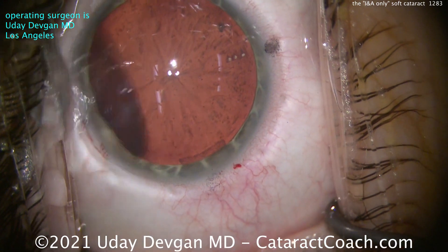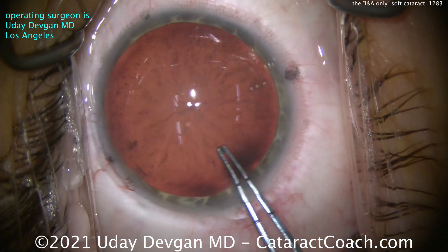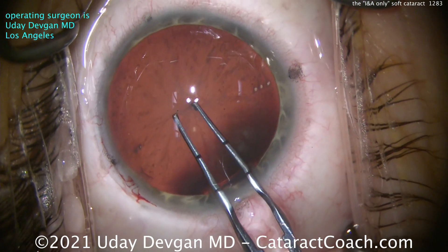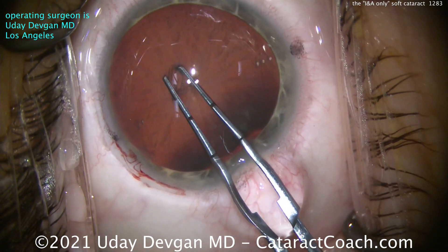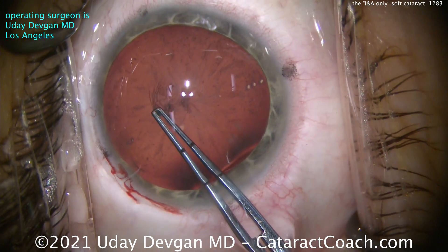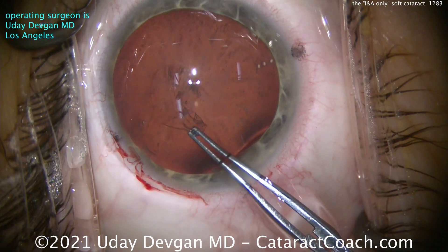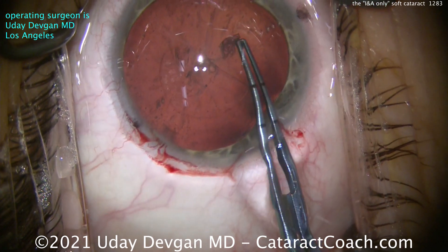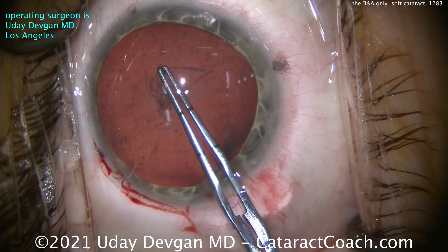In a young patient like this, you've got to be very careful. This lens capsule can be more elastic, so I'm going to try to make our REX maybe even on the smaller side — 5.0 is probably a good goal. Look how soft that lens is when we poke in. Getting that 5.0 millimeter REX — notice how when I tear the REX I almost have to keep bringing it in. It wants to run out because it is a little more elastic, so we'll be careful here.